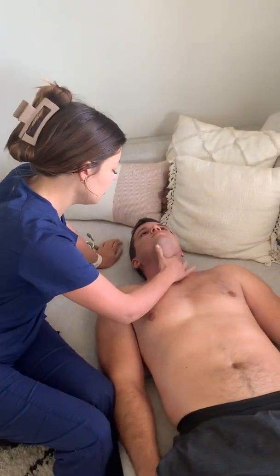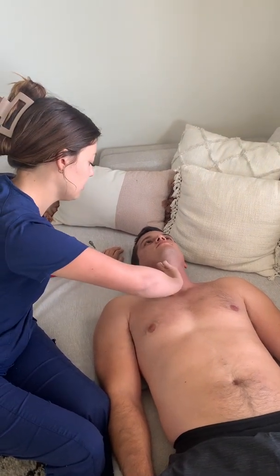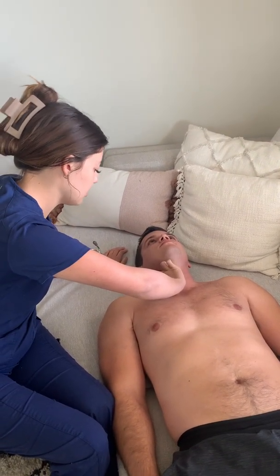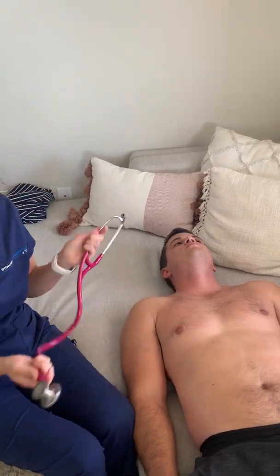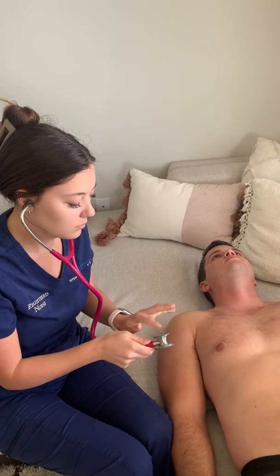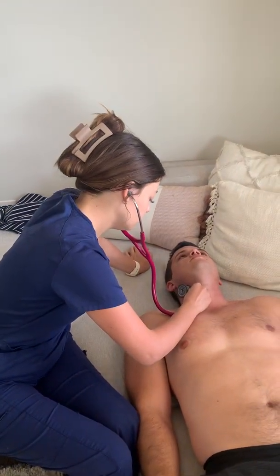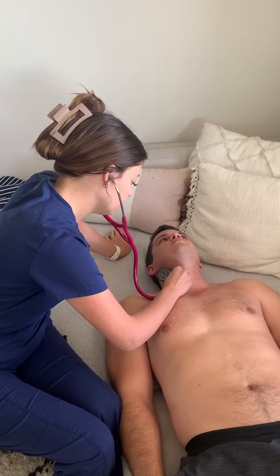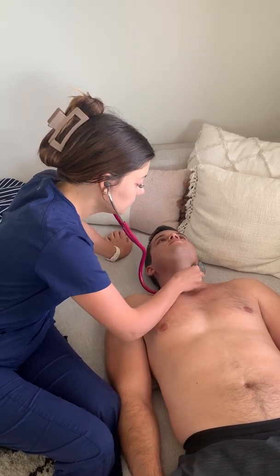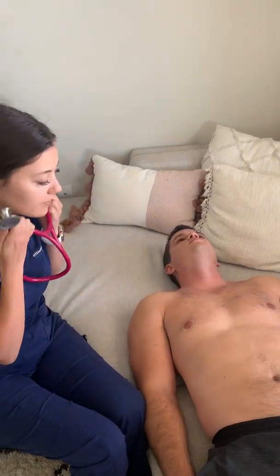So we're going to start over here. 2+, excellent. Right here. Great, 2+. And again, I'll listen with the bell of my stethoscope. Great, I didn't hear any bruits.